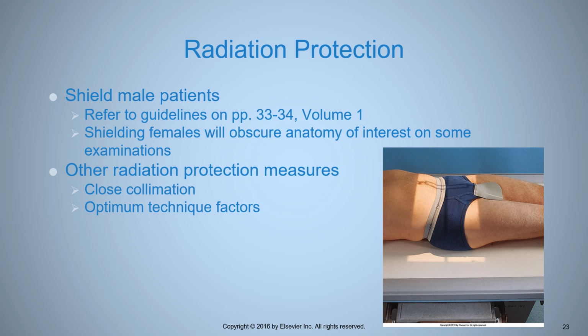Other methods of radiation protection only use the amount of collimation, that is the amount of x-ray beam that you need. Okay? For the pelvis, you open to 14 inches by 17 inches. For a single hip, you do not open to 14 inches by 17 inches unless the patient has a hip replacement, a prosthetic. And so we're assessing that on the front end. Have you ever had any surgery on your hip? Right? If there's suspicion of hardware in there, then you would open up your hip radiograph to a larger field.